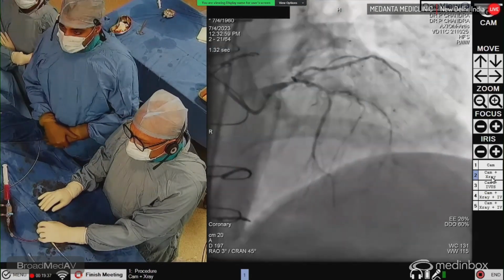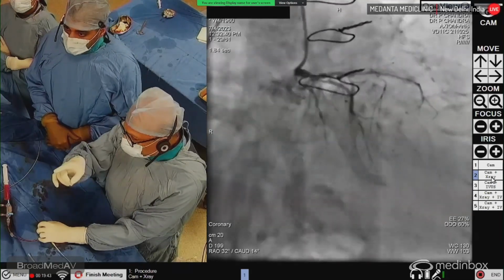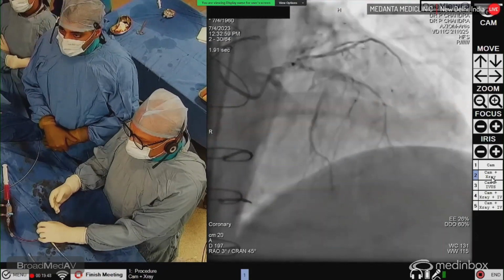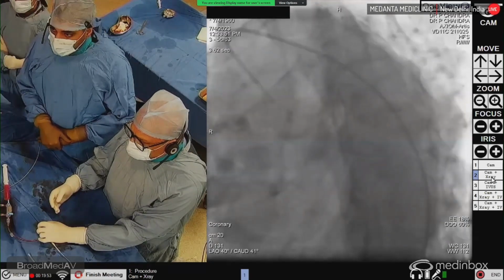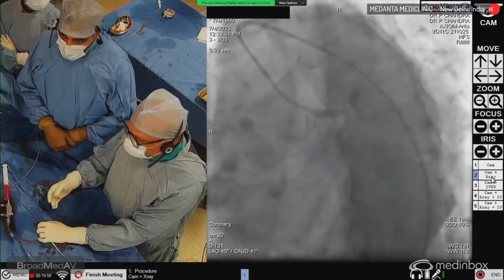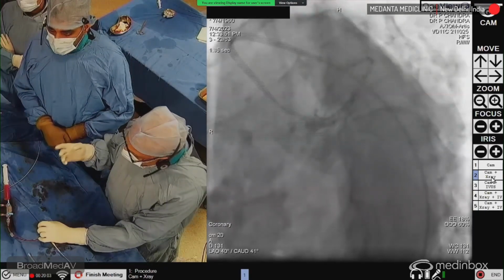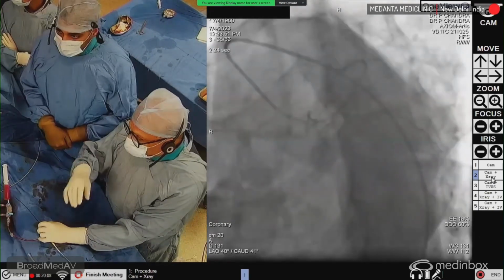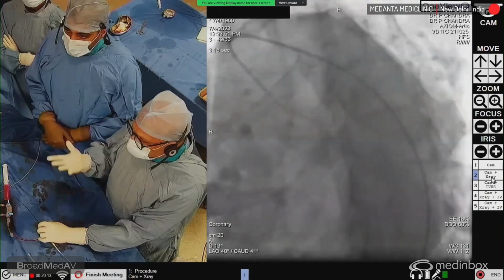Yesterday, when the patient presented, we did the angiogram, which showed LAD having 100% occlusion. The stent is also seen there, in the proximal LAD. Circumflex is also 100% occluded. You can see the capping of the ramus, which is also 100%. It is a large vessel. Here, Abhinav, what we see is that there is nothing we can really do to the native vessels, because these days we have more inclination towards treating the native vessels in a post-CABG patient. Yes, exactly. All these native vessels are really degenerated.